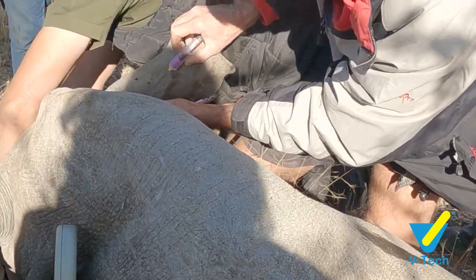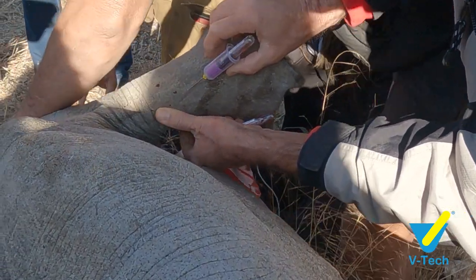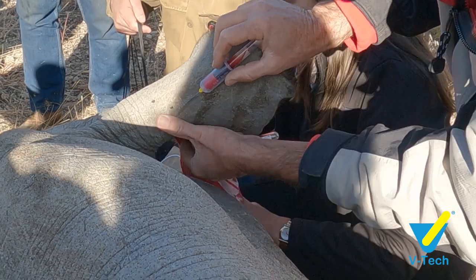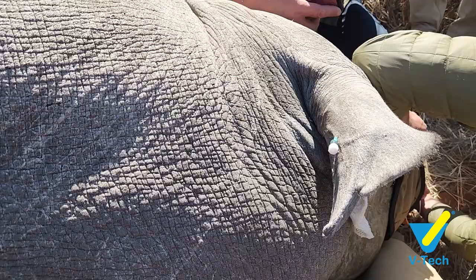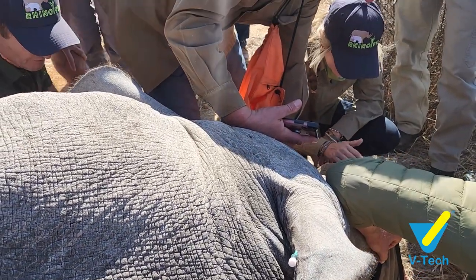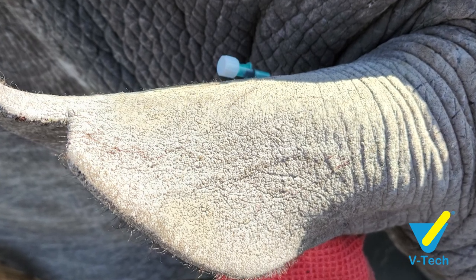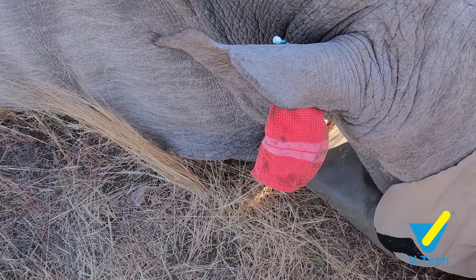For the ear vein technique, you occlude the veins at the base of the ear and you'll see them nicely pop up. Then you use a 21-gauge vacutainer needle screwed into a bulldog, and you insert the needle as you would with a normal small animal. You attach the vacutainer tube at the back and you'll see the blood clearly pouring into the container. That's the easiest and quickest way, and it's the best method if you just need a DNA sample.